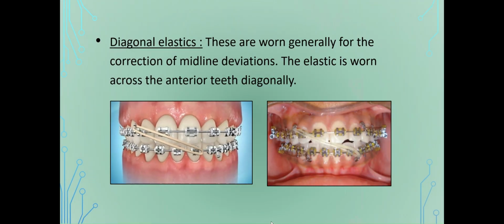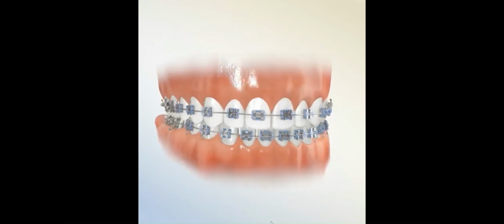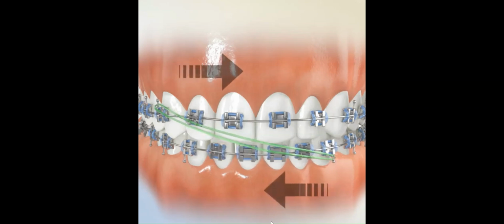Diagonal elastics. These are worn generally for the correction of midline deviations. Here we can see the correction for the shifted midline in the mandibular teeth. The elastics are worn across anterior teeth diagonally.